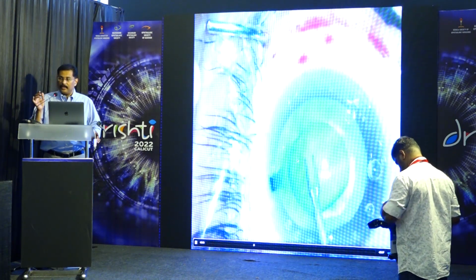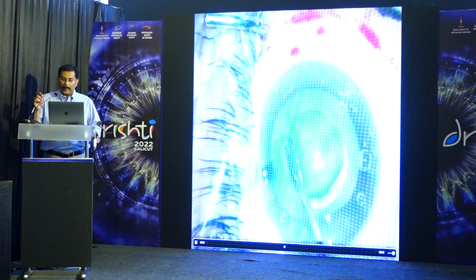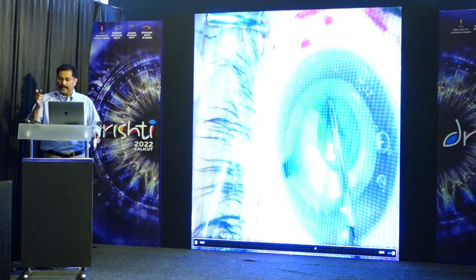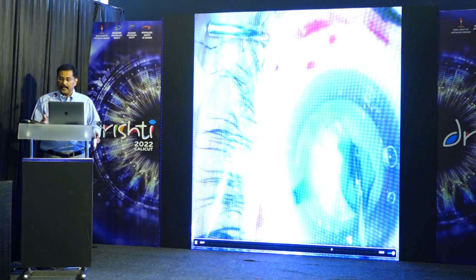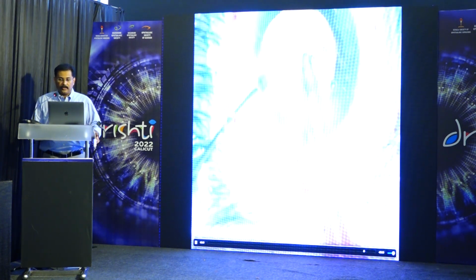So when I am catching onto the capsule, I don't just pull out, I just lift up that area and see where is the connection, and just go beyond the connection and include that area and make it a slightly irregular one, but then still see the part getting included in the rhexis, and it becomes more uniform. And this is how it looks at the end.